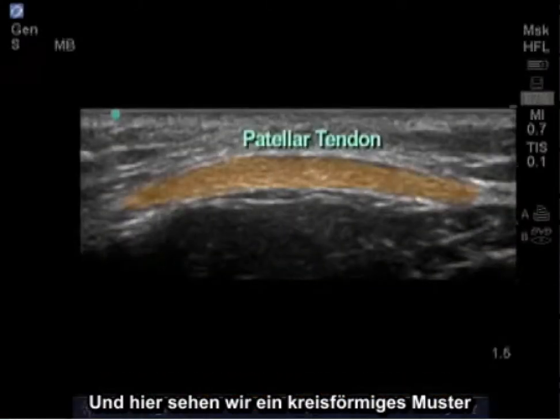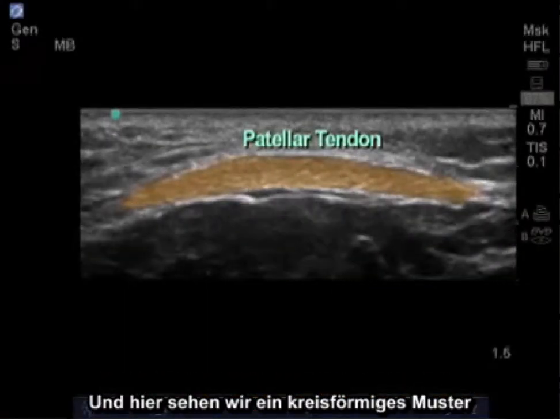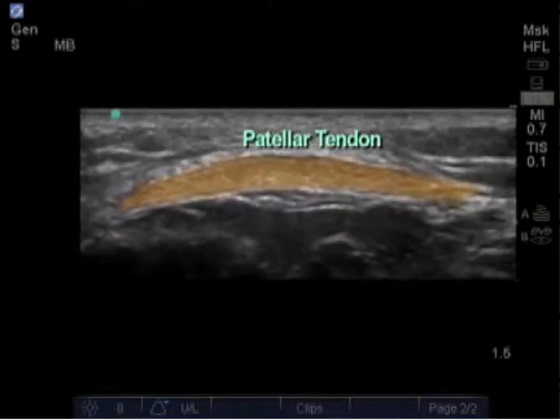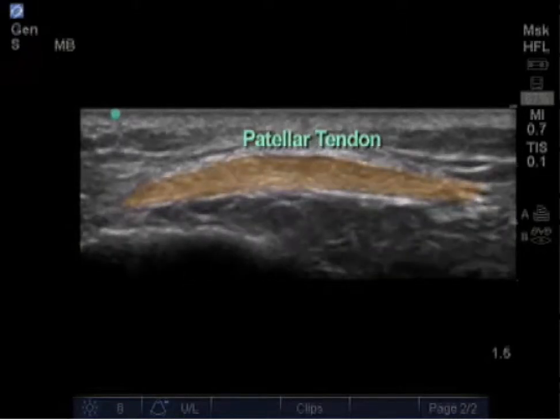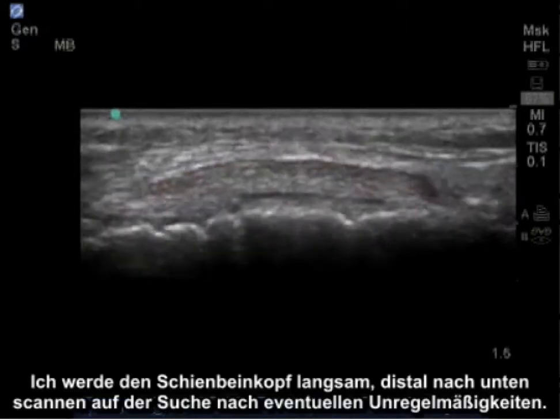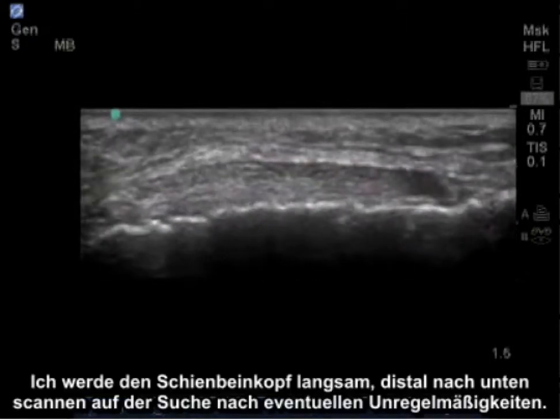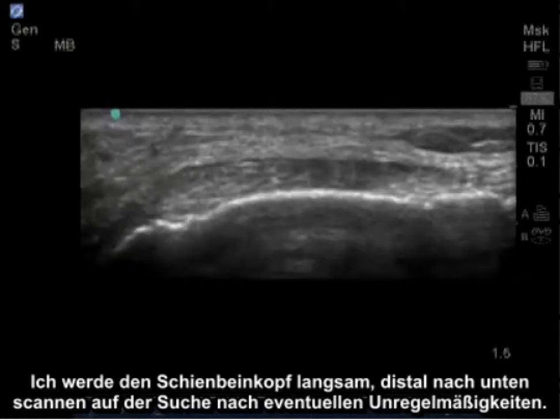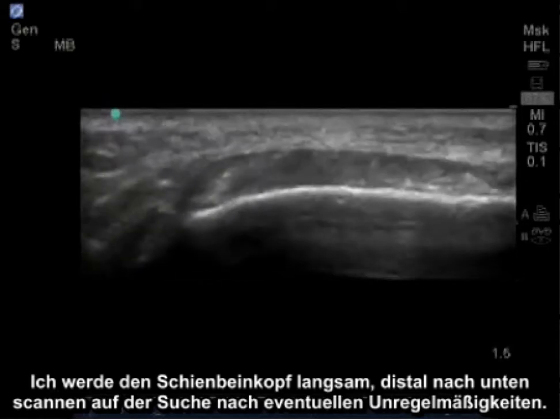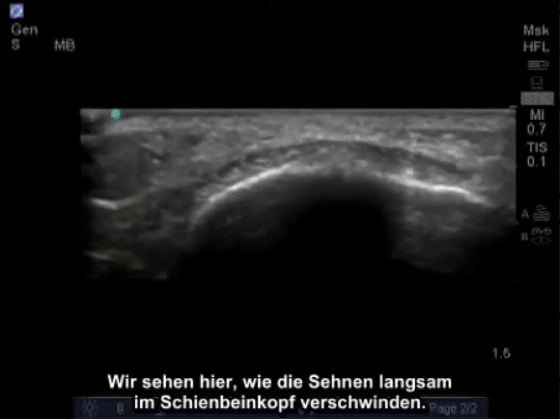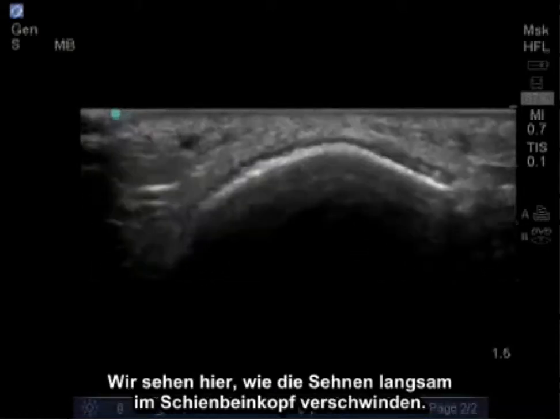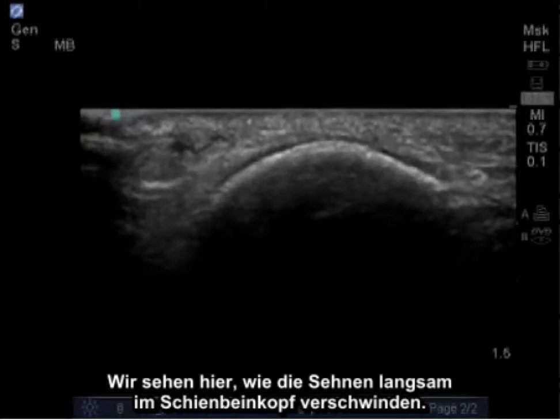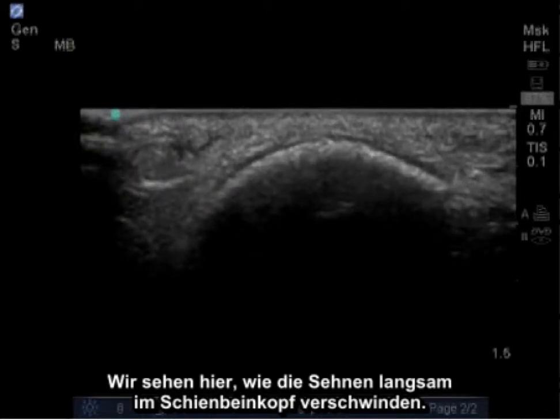Here we're going to see a circular pattern of the patella tendon in cross-section, looking for any abnormalities. I'm going to scan distally down to the tibial tubercle, slowly looking for irregularities. We'll begin to see the tendon slowly disappearing into the tibial tubercle.